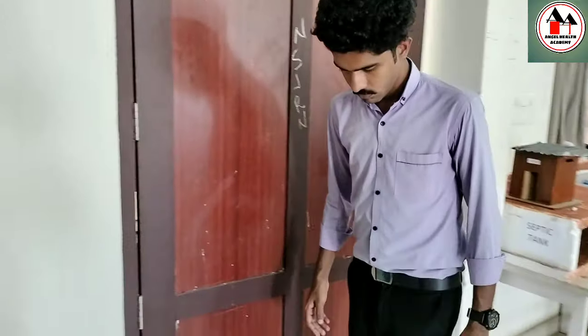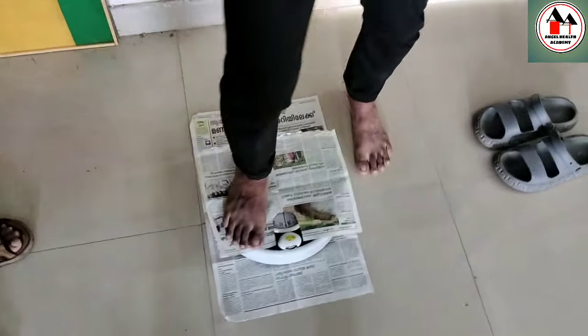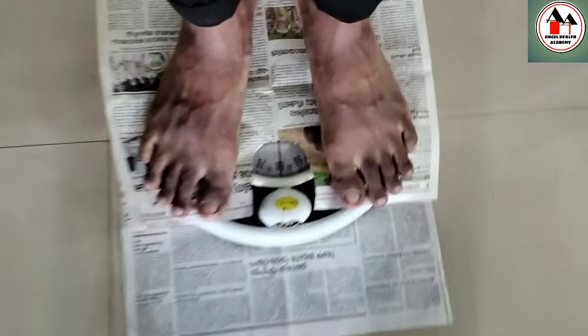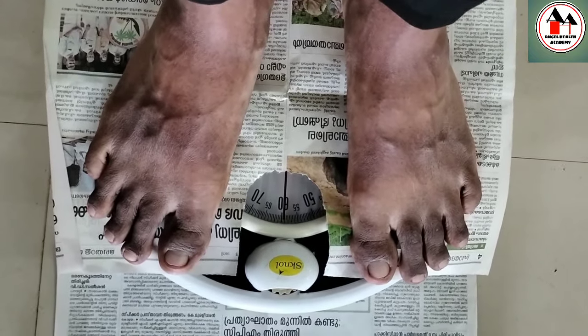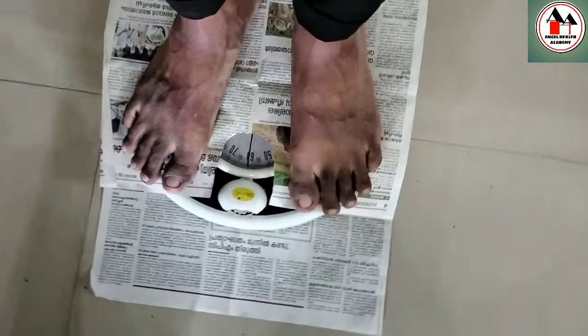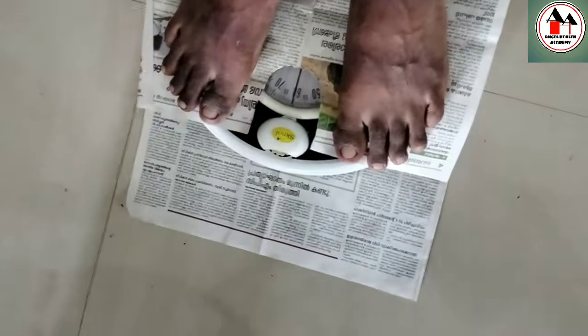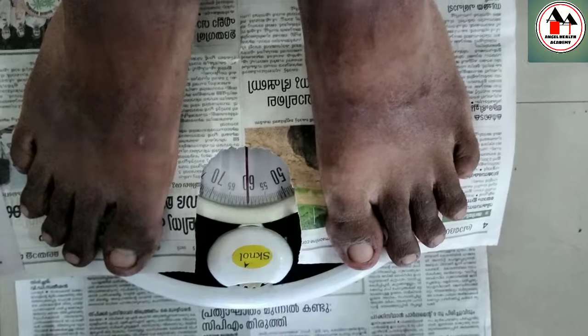Ask the client to climb onto the platform of the weighing machine, remove their slippers, and stand directly on the scale looking straight ahead. When you read the measurement, you have to kneel down or sit to read the scale at eye level — otherwise the reading may not be clear. The reading is correctly 60 kilograms.